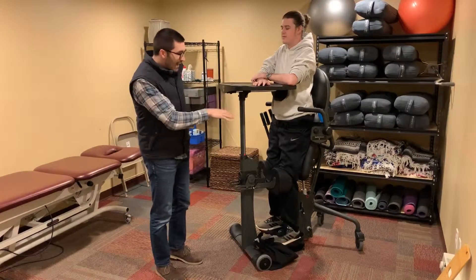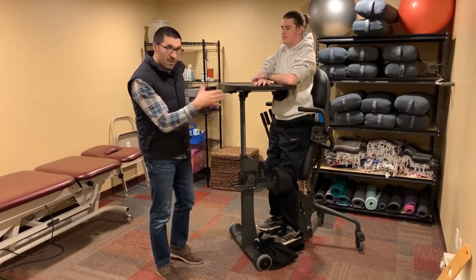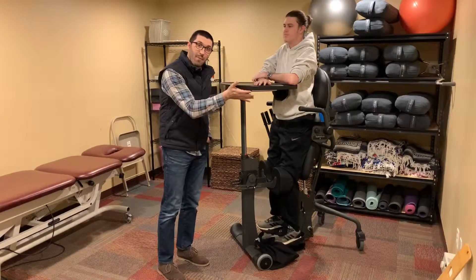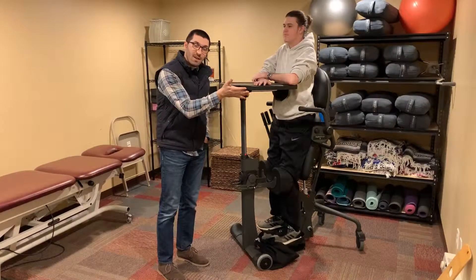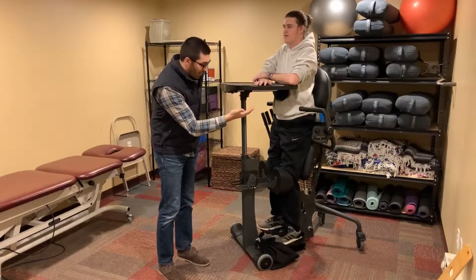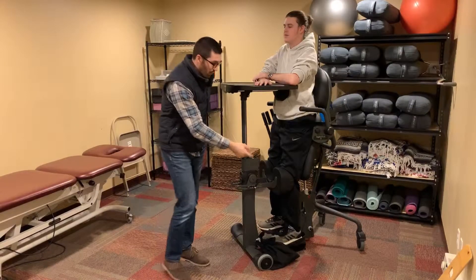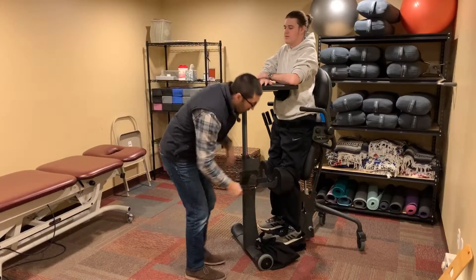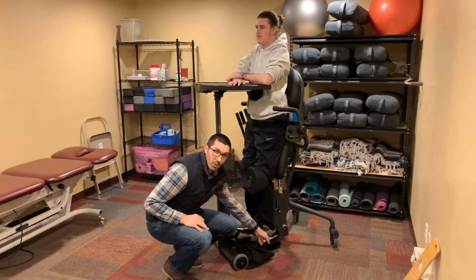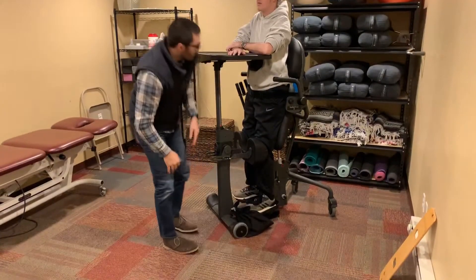Once we got in, we're looking to make sure his hips are all the way back in the seat, and then that the leg length down to the floor was appropriately adjusted with the foot plates.